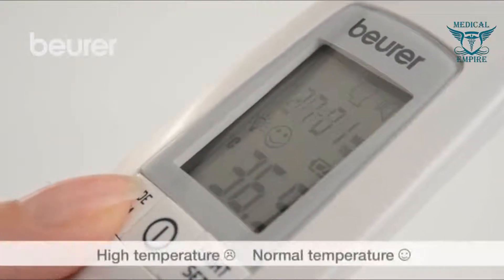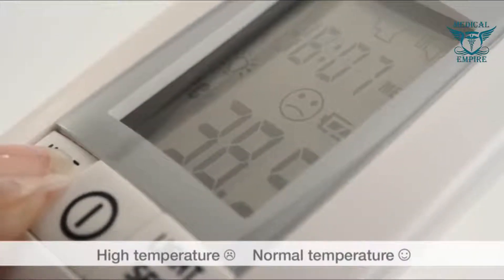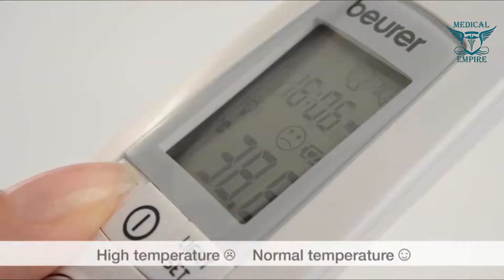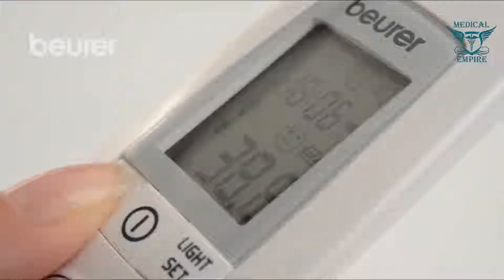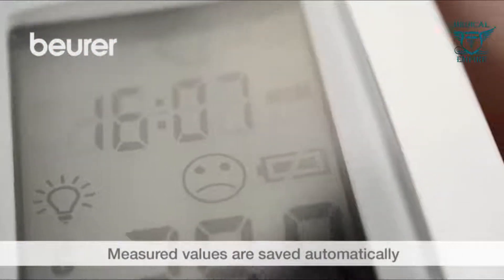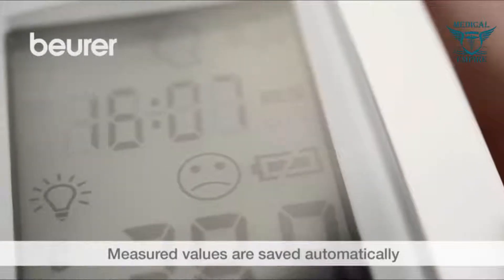Depending on whether the temperature is below or above the tolerance for a high temperature, the device shows a smiley face or a sad face. If the device detects a high temperature, it also beeps three times. The measurement is automatically stored. The device only stores measurements in forehead temperature mode with date and time.